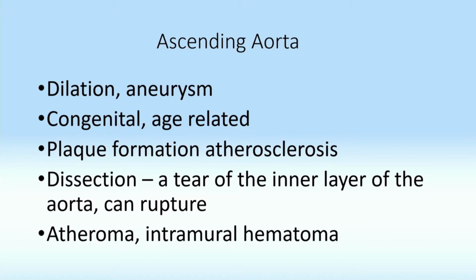It can be congenital or age-related. There is plaque formation in the aorta. We call it atherosclerosis, and we are able to visualize that. I will show it to you.